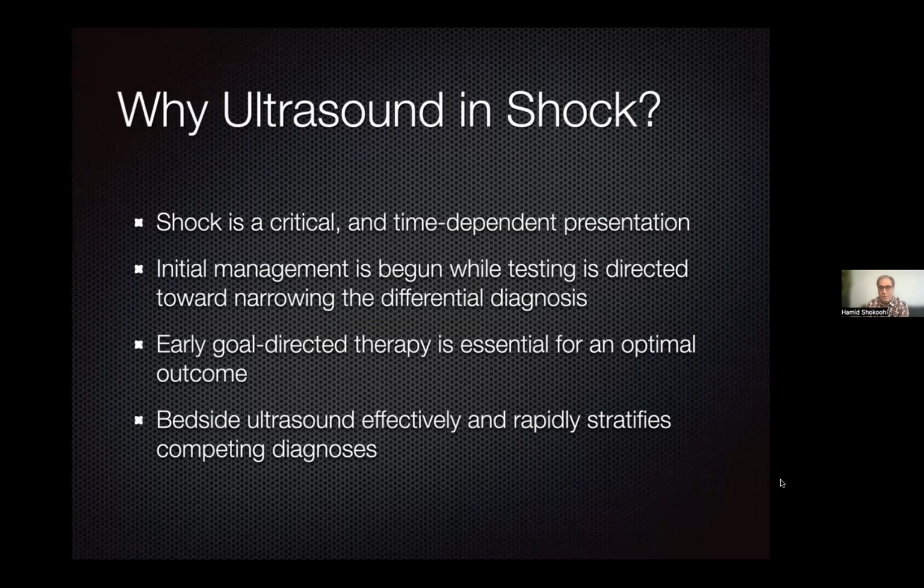For all these cases of shock, the first thing that comes to mind is to give some fluid and bring the blood pressure up. But this is one of the most complicated decisions that you are making blindly, by just giving or not giving. You say, okay, this patient I think has heart failure, let's just not do it.